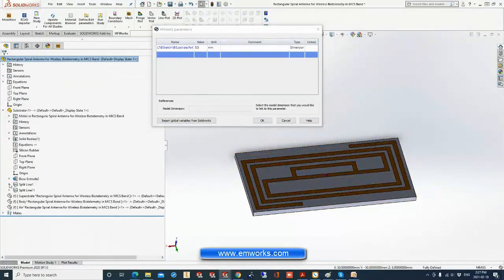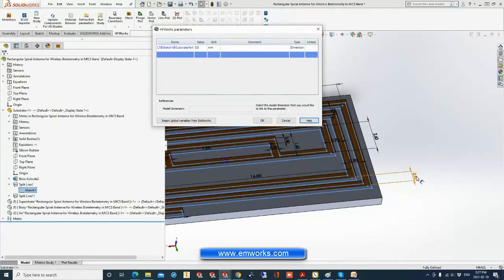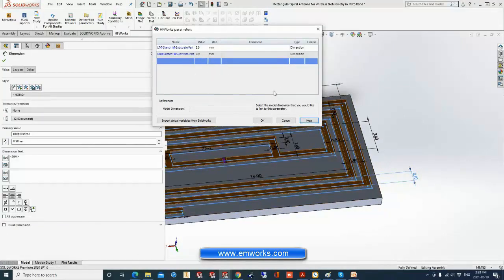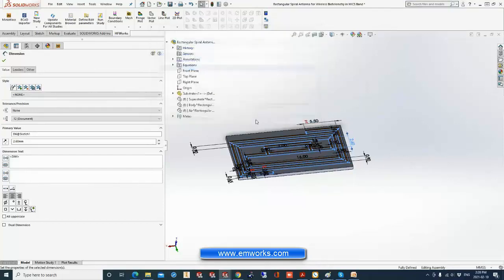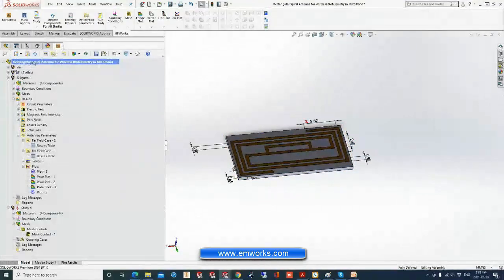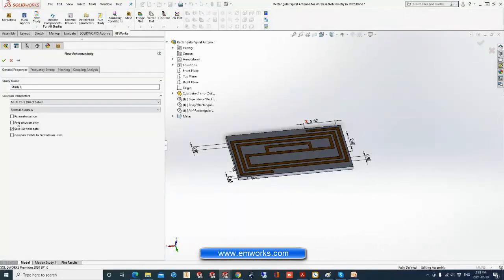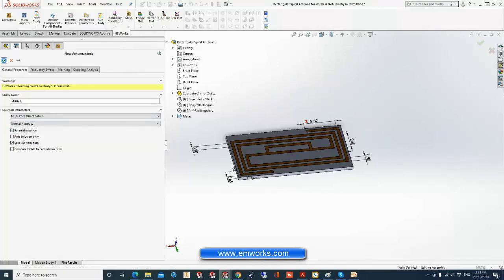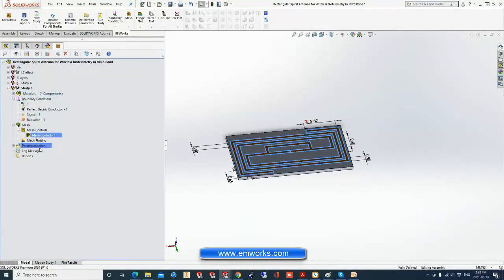We can select any other parameter. You just come here and pick any parameter, for example, this one or this one, or any other. It can also be just a mate between parts. You pick any one, come here, and instead of creating a regular antenna study, you check parameterization. You can simply copy and paste everything from the previous study, the material, boundary condition, and you come to define your scenarios.